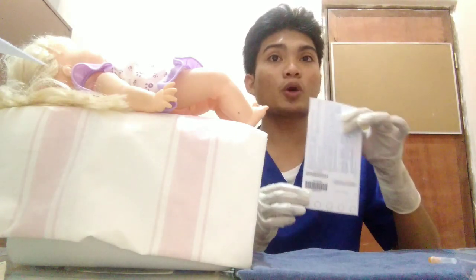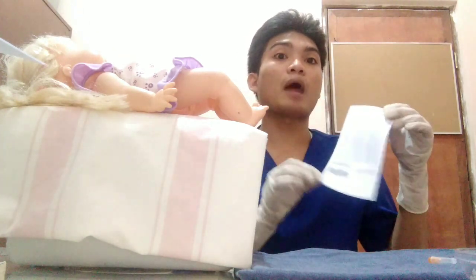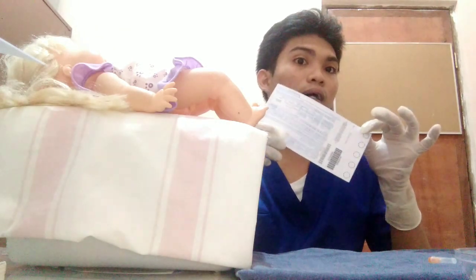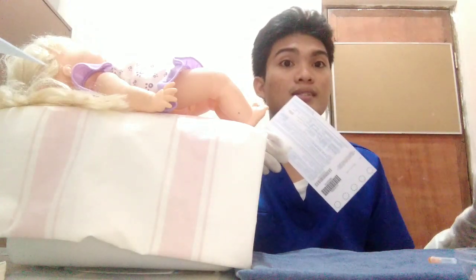Now, we will be mailing the completed form for testing the laboratory within 24 hours of collection. So, yung results ng newborn screening will come out after 7 working days.